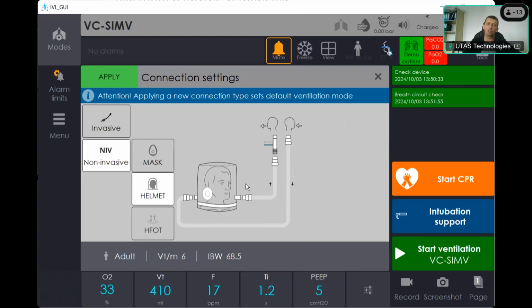In basic configuration, both channels, SpO2 and CO2, are available by default, and the SpO2 sensor and cable are always available in the basic configuration set. But the capnograph CO2 sensor itself is an expensive one, so you have to specify if you need this option, this sensor, or not. But again, all ventilators in basic configuration are ready to plug and play a CO2 sensor and to have CO2 monitoring, including volumetric capnometry. Any questions here?